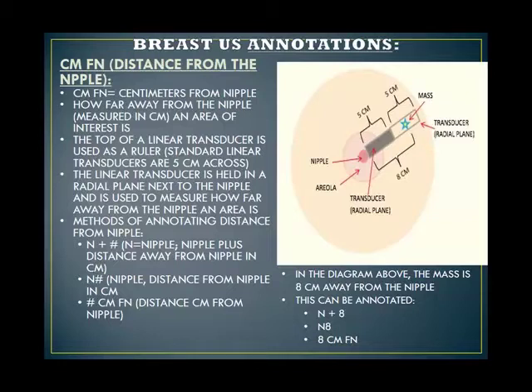Not really. Not so much in breast imaging, but the radiologists talk in those terms, so it's really important to know what they mean. Yeah. So here's our transducer. In breast imaging, we use the clock method, which breast it is, and then centimeters from nipple. And this tells us how far away it is.